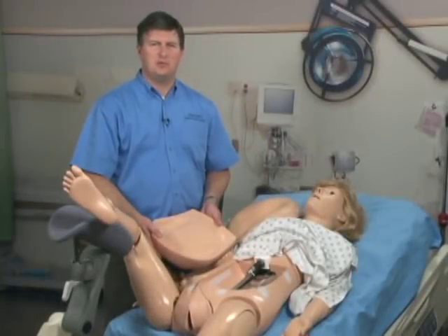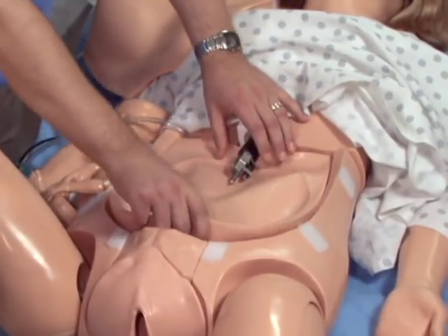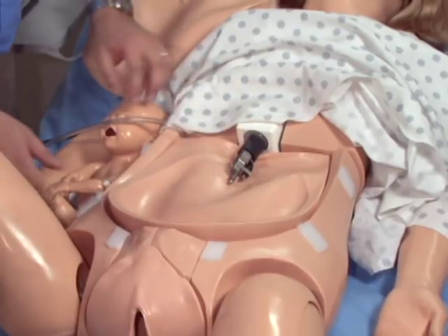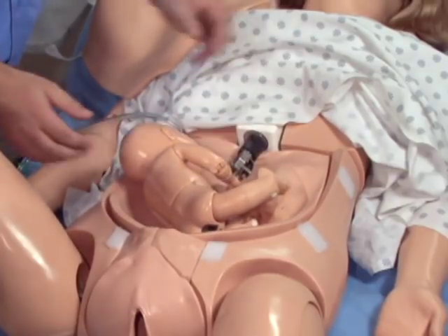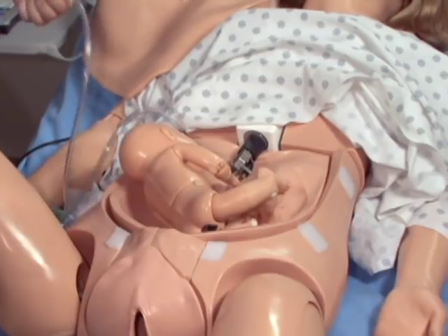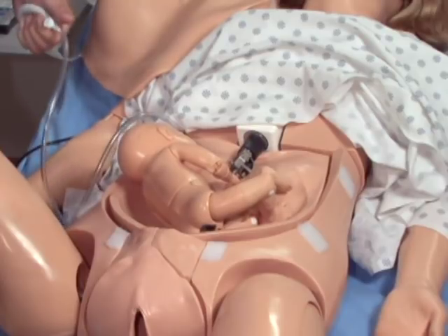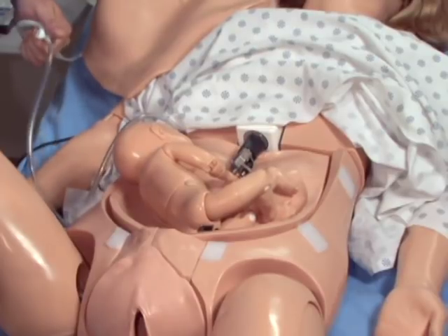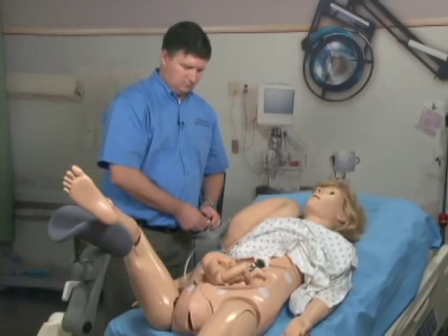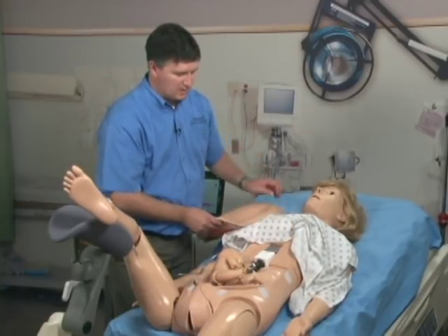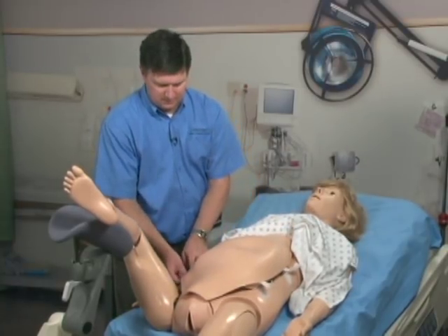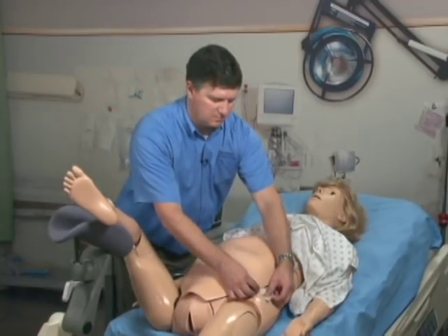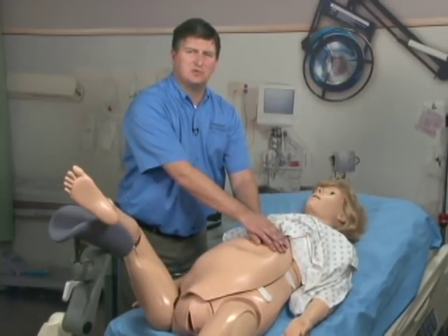To perform Leopold maneuvers, we must first insert the inflation pillow. Slide the top end underneath the attachment mechanism. Position the baby on top of the pillow, however you wish. Then, using the hand pump provided, inflate the pillow to raise the baby. Next, place the C section abdominal cover in position. You are now ready to begin your palpation maneuvers.